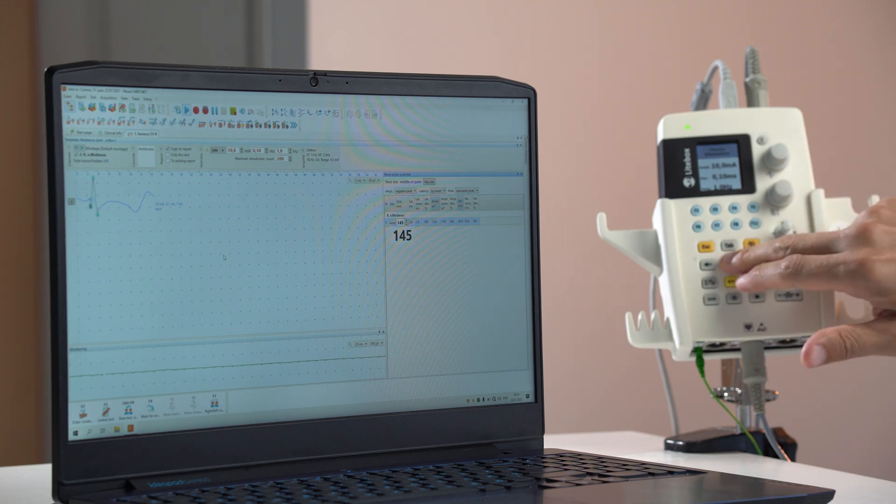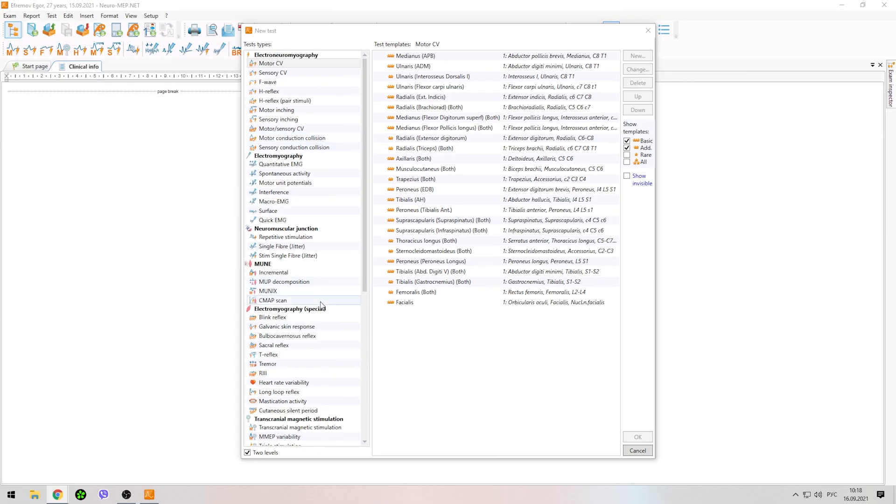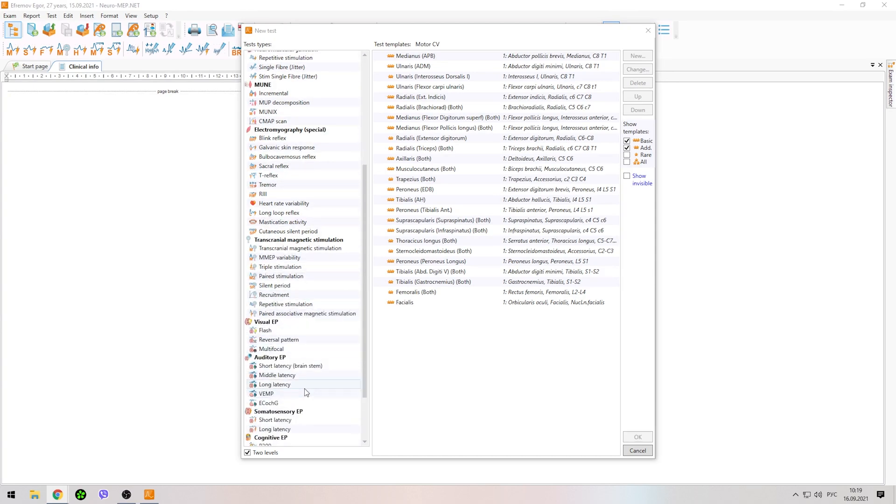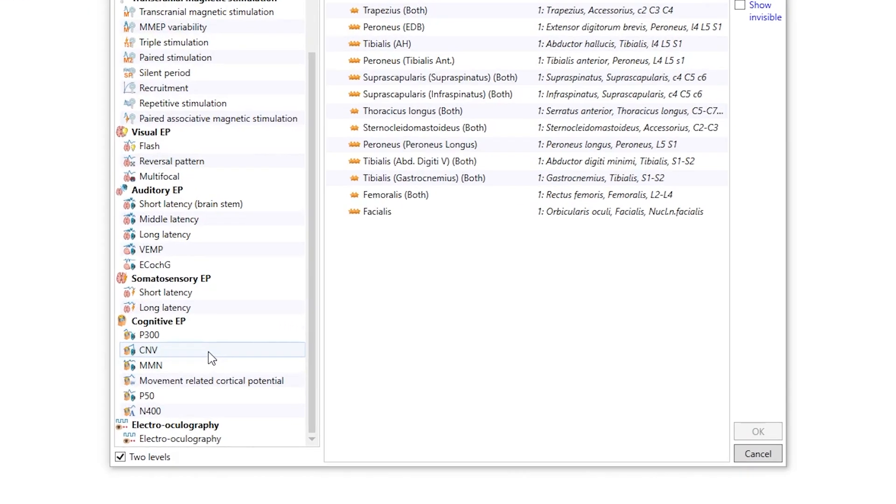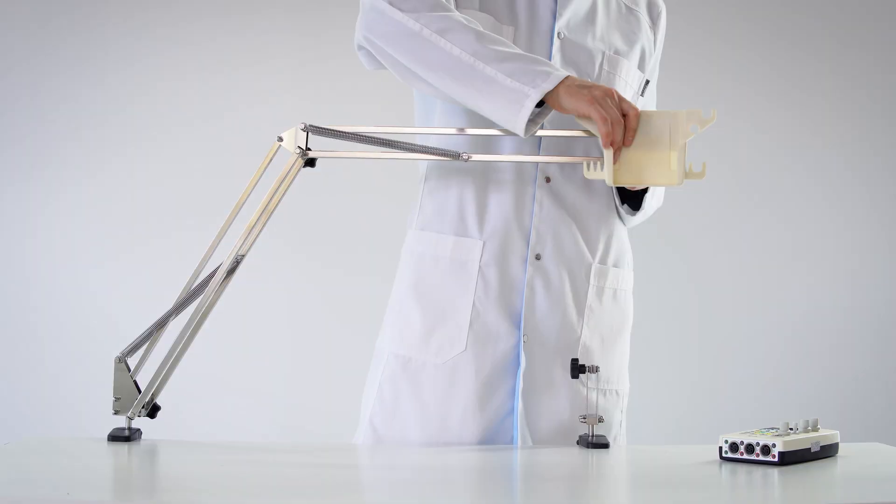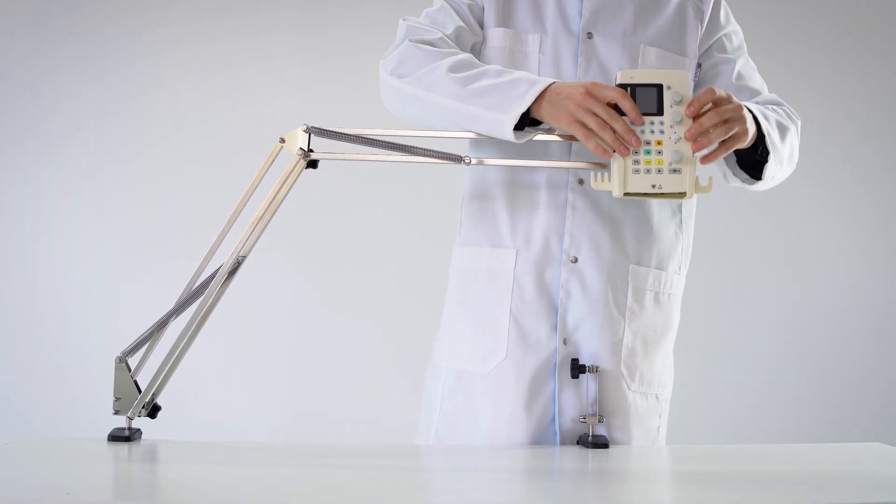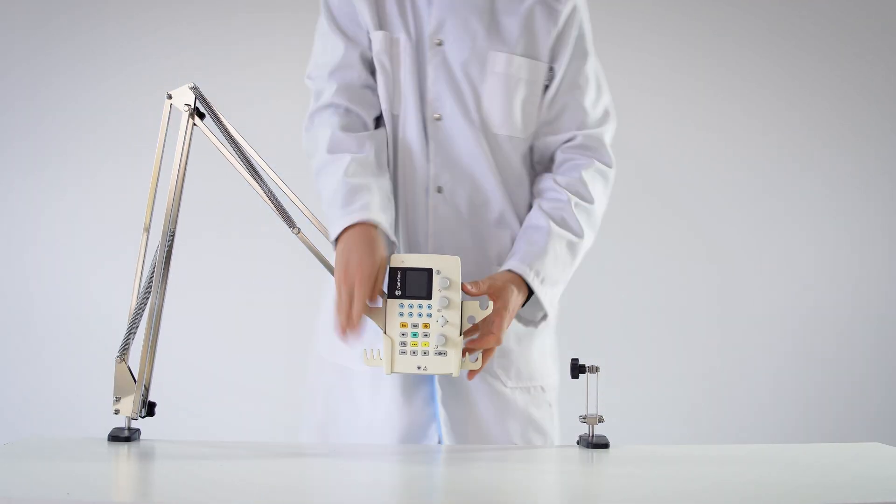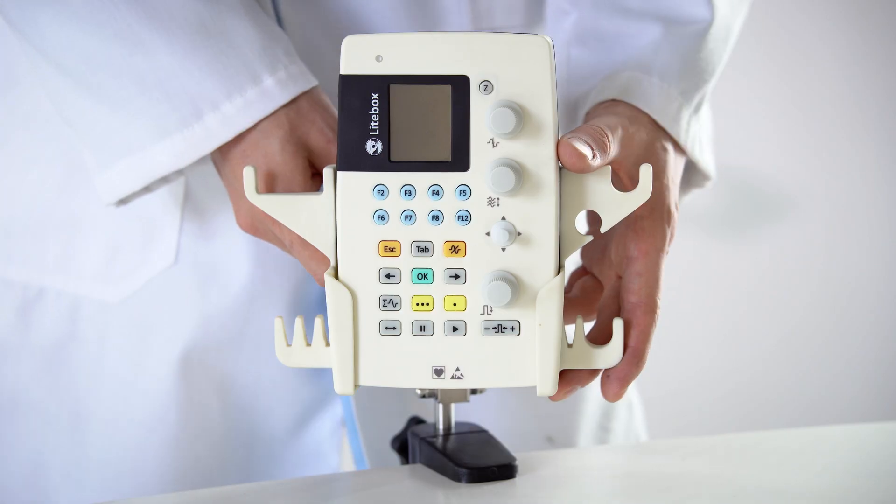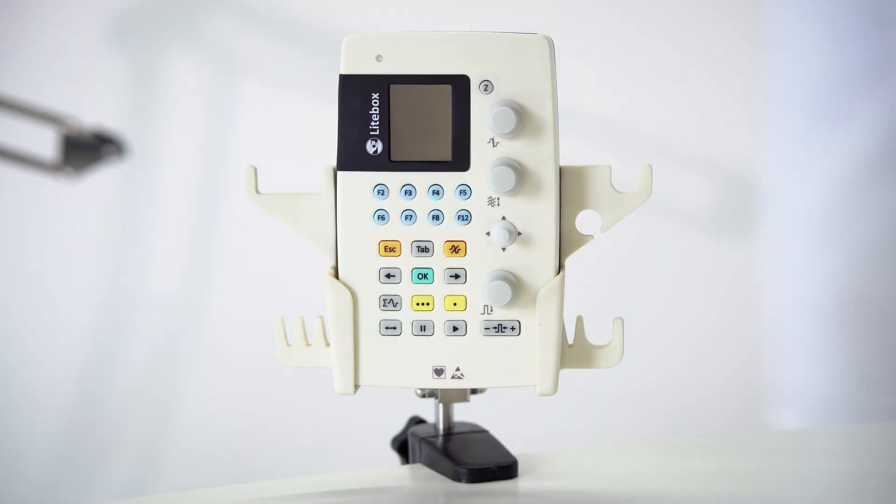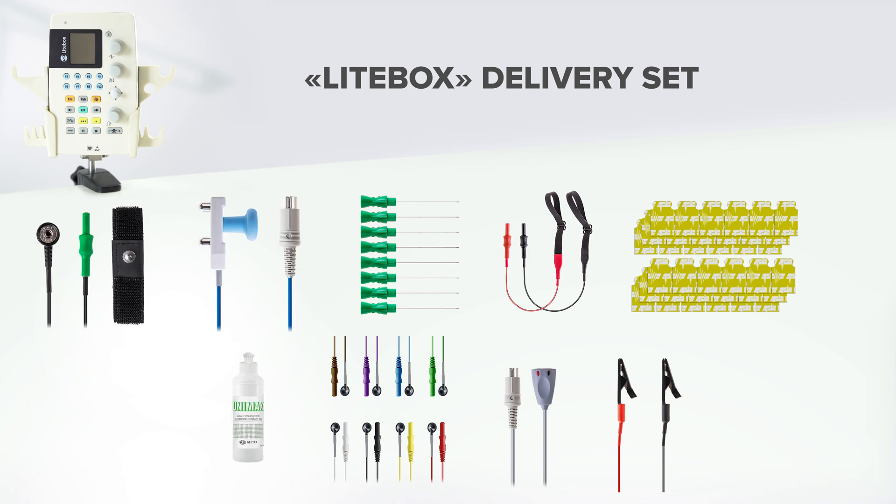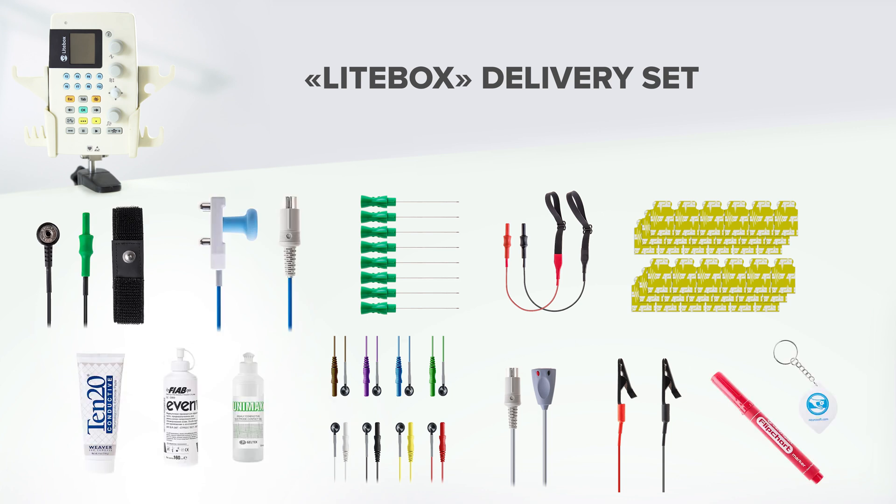The device allows for over 50 EMG techniques including needle EMG, auditory, visual and somatosensory evoked potentials. Lightbox is supplied with the holder for convenient placement of high-quality electrodes, cables and other accessories for EMG and EP also included in the system.